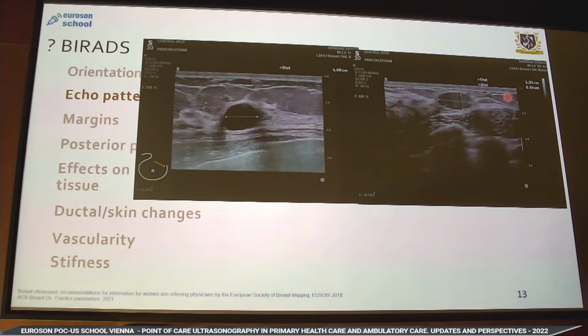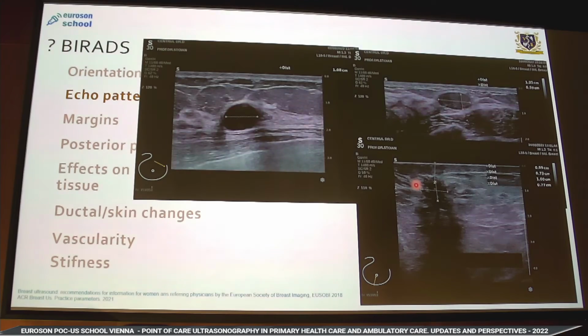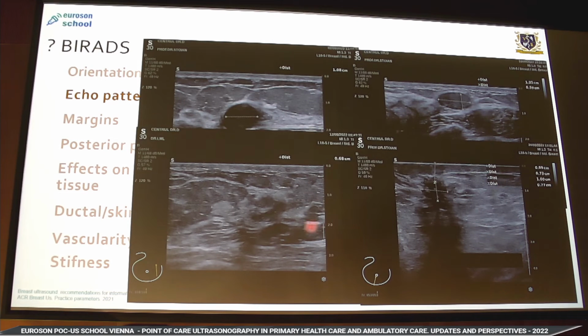I'm not a radiologist and I cannot think in images, because I think in hormones and in clinical picture whenever I see an ultrasound of a female. And as the vast majority of you being clinicians, I think it's the easiest way of thinking. Clearly hypoechoic lesion, not transonic, and we have different clues to know that this is a solid and not a liquid one. Again, significantly hypoechoic to the fatty tissue, again thinking in layers and re-emphasizing this. And this one is a hyperechoic lesion, hyperechoic to the fatty tissue.